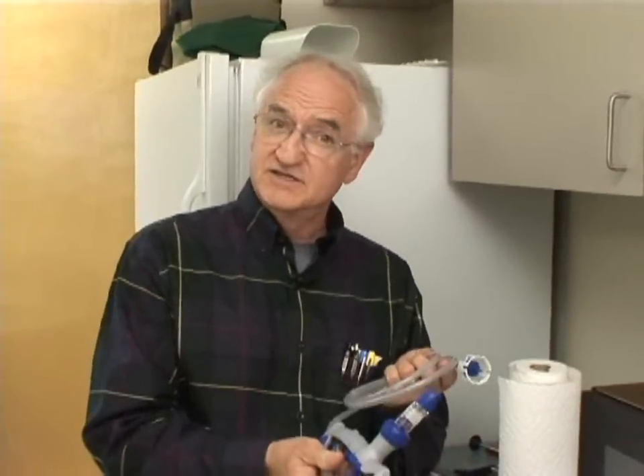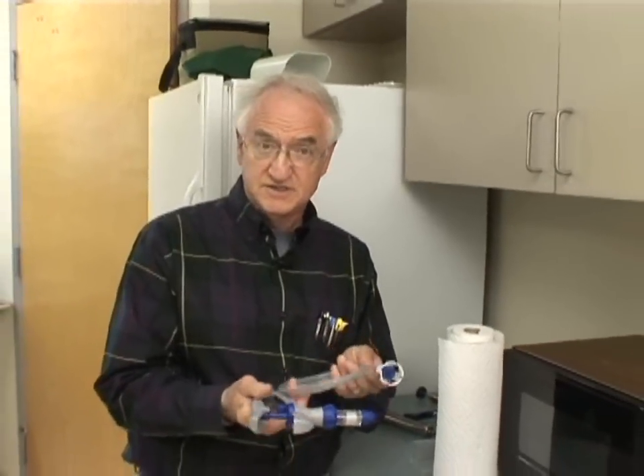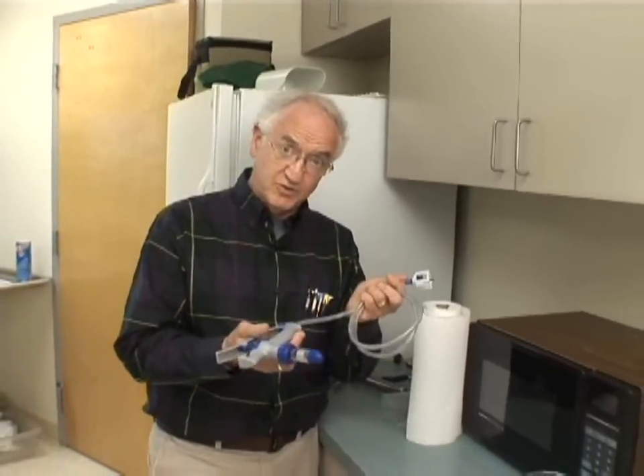Alright, so we're going to talk about sterilizing syringes. This happens to be a 5cc vaccination syringe, but we could also use it for medication syringes. And we'll assume I've started with a clean syringe.